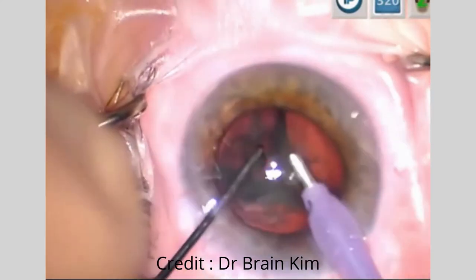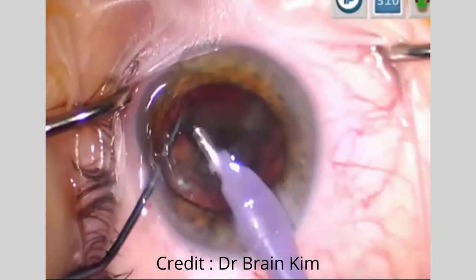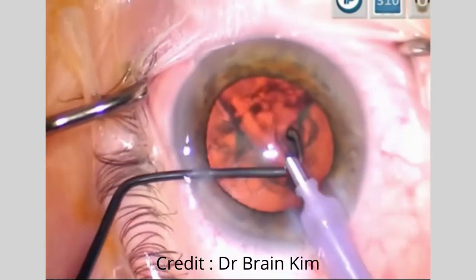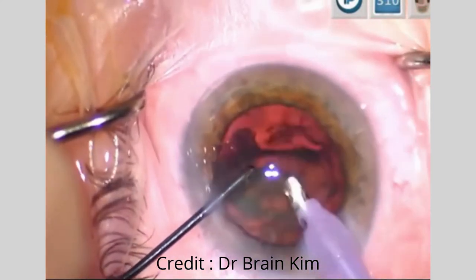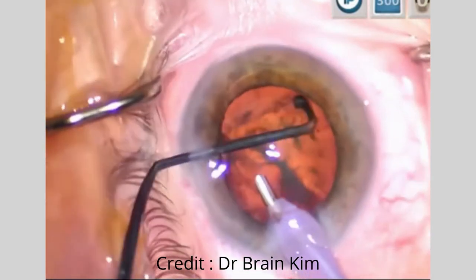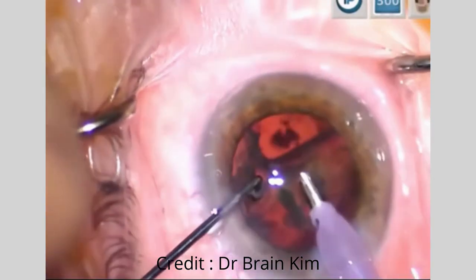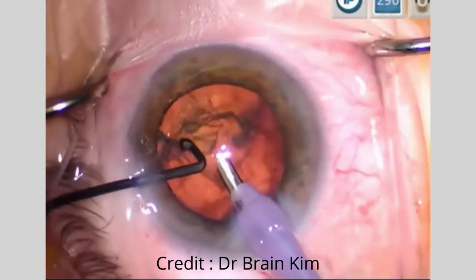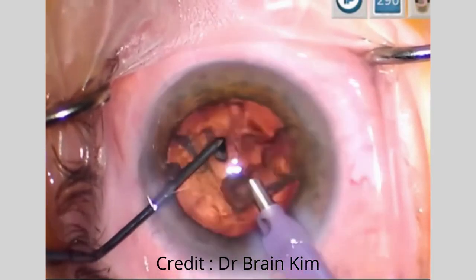In summary, the chopper maneuver involves keeping the wrist pronated so that the chopper tip is facing out into the periphery. Push down a little bit into the epinuclear material on the surface of the lens, and as you slide out past the anterior capsule, you supinate your wrist so that the chopper then faces the phaco tip — this is the ready position. Place the phaco tip bevel down, sub-incisionally, into the epinuclear material but outside the level of the endonucleus, bring the two instruments together, and you chop. The pronation and supination move to harness the lens at the level of the equator, bringing the chopper centrally to meet the phaco tip in the middle, and fracturing purely mechanically without any energy or vacuum, is my fundamental technique.